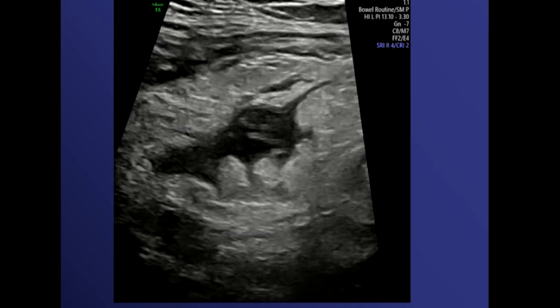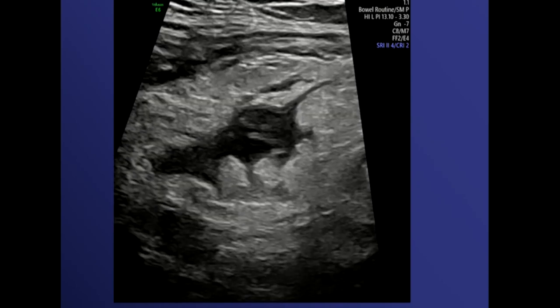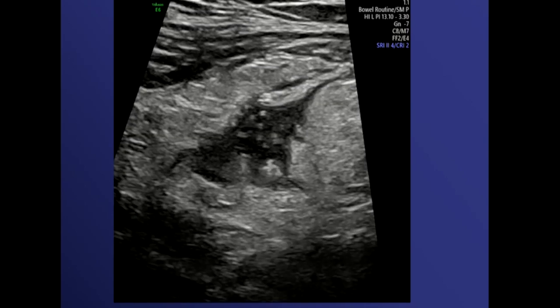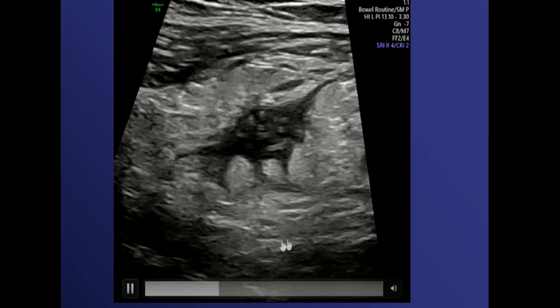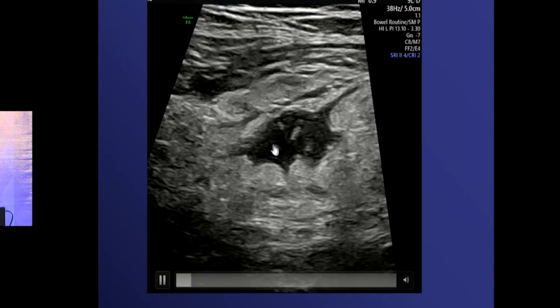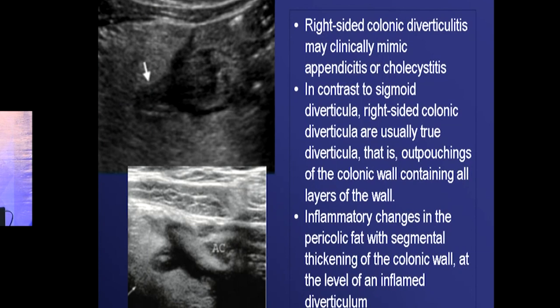Differential diagnoses for right iliac fossa pain: one patient suspected of appendicitis showed linear structures — this was actually tapeworm infestation, not appendicitis. Another important differential is diverticulitis. Right-sided colonic diverticulitis may clinically mimic appendicitis or cholecystitis.